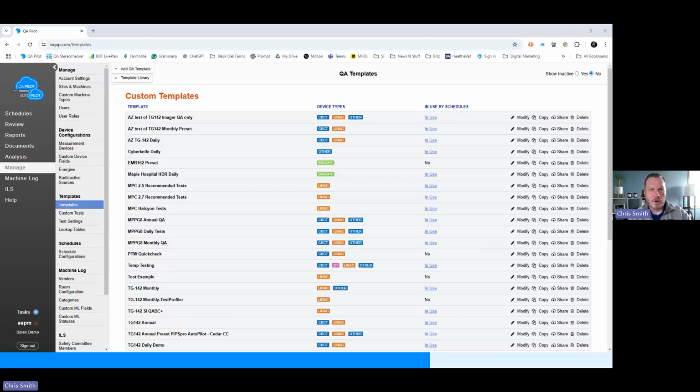What are you missing out of your current protocol? Okay, we can get that done for you. We can add those components. So even if your question isn't necessarily administration based, but it's more like, how do I improve my workflow and how do I get better standardization? Those are the conversations we would probably have first, almost consultative in nature. And then as the last byproduct, we manipulate and modify QA pilot to address your pain points.